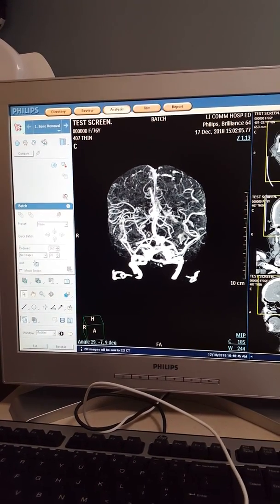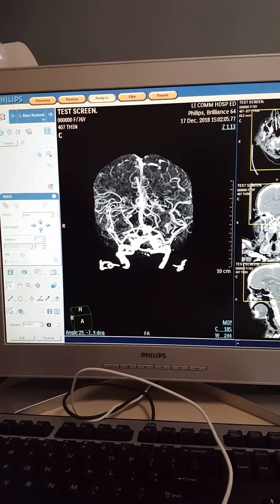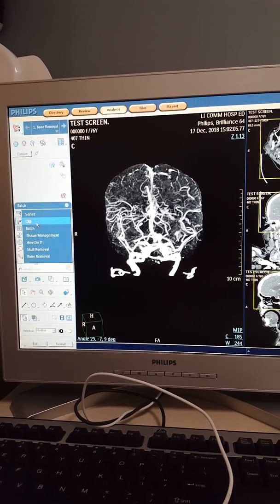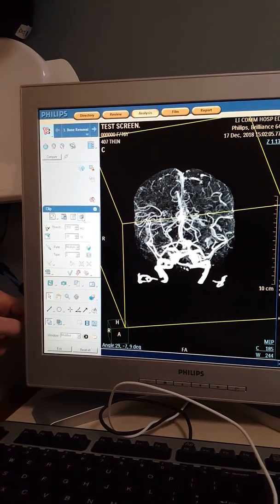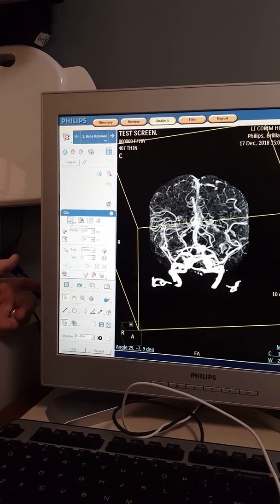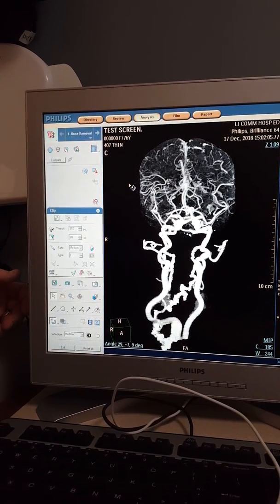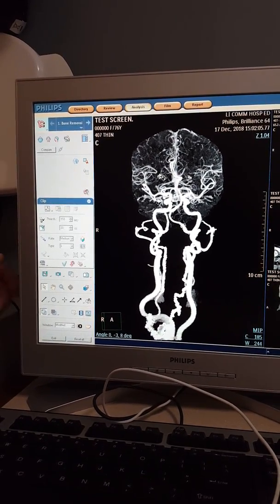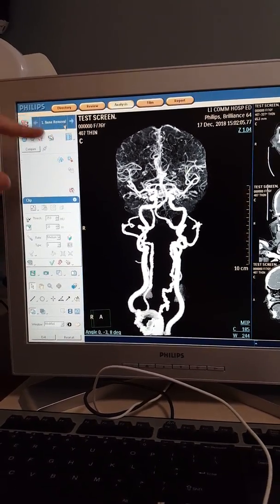Now we want to work backwards. I always click the undo button — it brings your boxes back. Instead of left to right, we're going to go back to clip, because that's what we did to get here. Click clip, go to your hide-show box and click it, then click the target volume box — that brings everything back. You can shrink it up a little bit and move it to where it was to begin with, but it doesn't matter much. What comes next is vessel extraction.